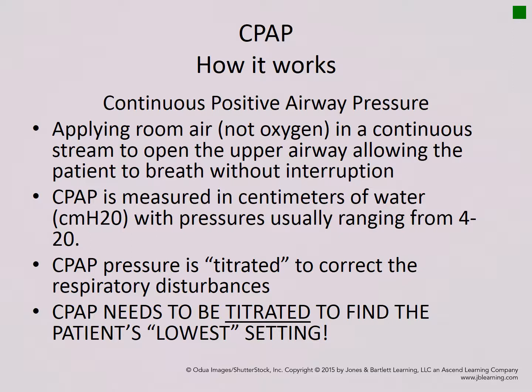That's just not enough. Now, a lot of times people refer to flow, and that's in regards to oxygen therapy. CPAP is completely different than oxygen therapy. Oxygen is a drug. It is an increasing amount compared to what is in our atmosphere when we use oxygen therapy, and we're just talking about positive airway pressure. So this is just the flow of regular room air pushing the airway open.